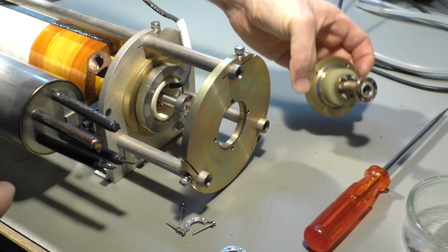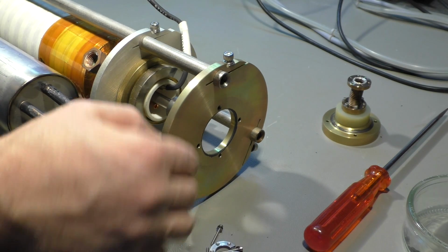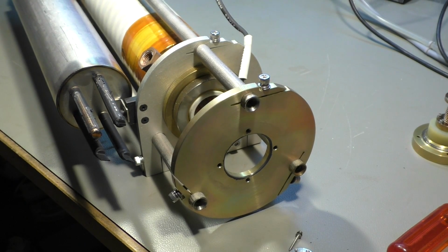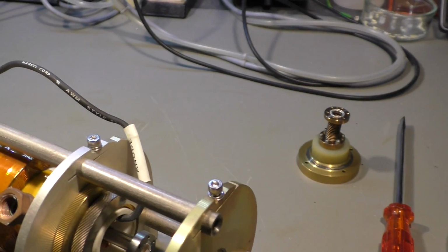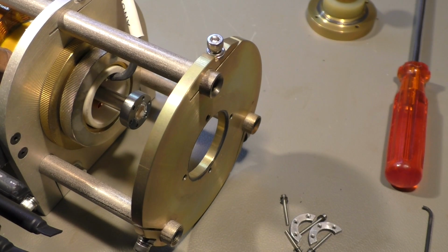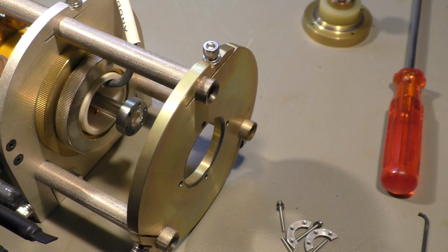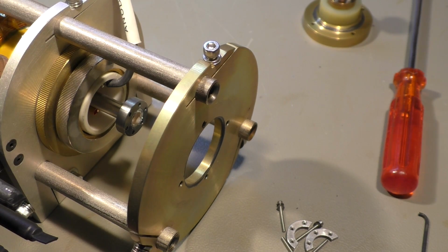Let's see inside. So the gas, I don't think it escaped, it's more like a low pressure inside this tube. But the gas inside would be argon, which is not toxic, at least not in these small quantities. Okay, there is not too much to see. I will try to open that screw here.